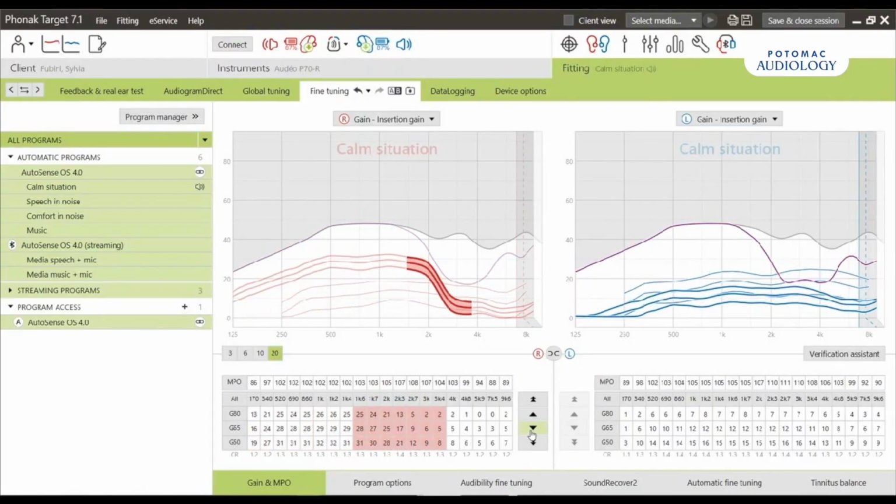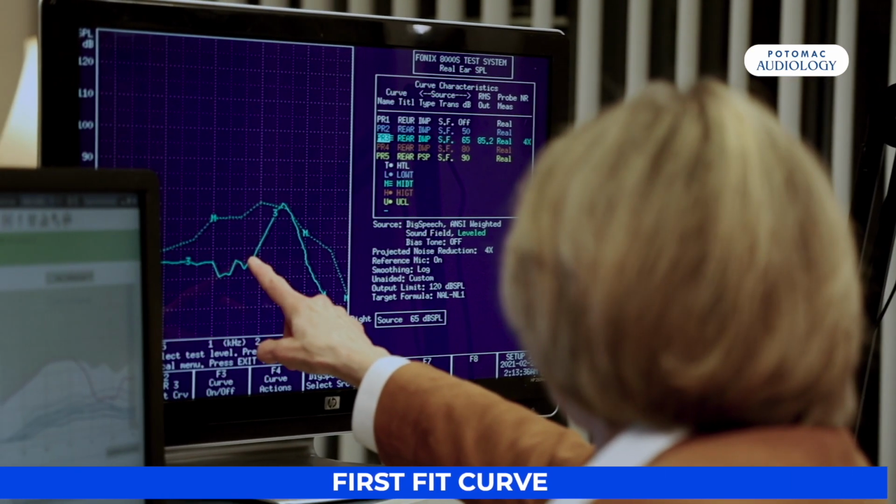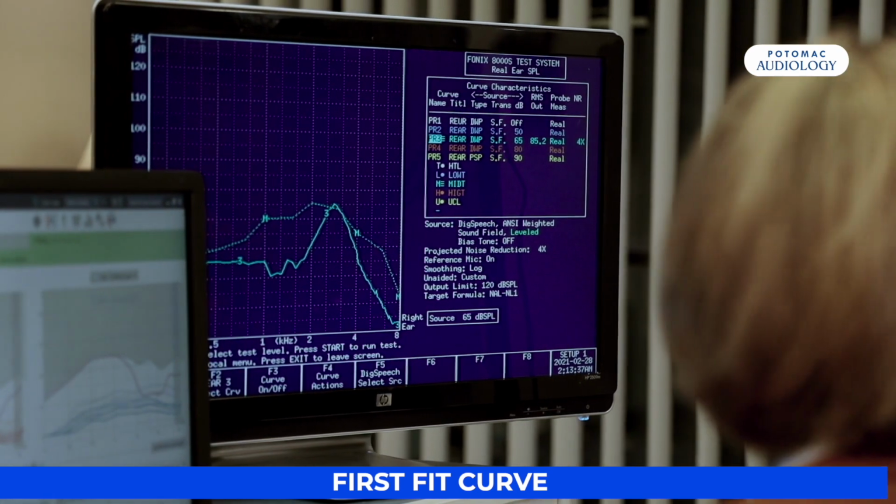So if you're not measuring what a hearing aid is doing, basically you're guessing. And as I said, only about 10%, maybe 15% of the people that dispense hearing aids measure. The other 85 to 90% don't. So what they're doing is that the software from the manufacturer calculates what they think should be coming out of the hearing aid. But again, that doesn't take into account the acoustics of the patient's ear canal. So that is called a first fit. Whenever I do a first fit, the hearing aid is matching the prescription maybe 30–40%, or sometimes it's really off, it could be only 10%.